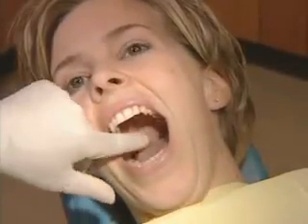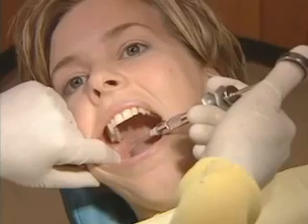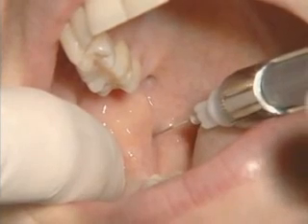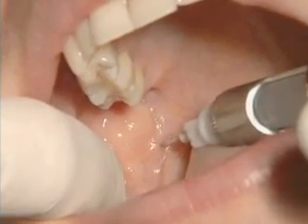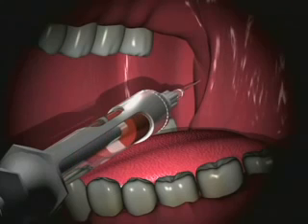After palpating the landmarks, you will be inserting the needle into the pterygotemporal depression. The needle is brought in from the contralateral side, and the insertion point is directly there, and you advance slowly until you go 25 millimeters. Once bone is hit, you withdraw slightly, you aspirate, and slowly begin to inject a full cartridge of local anesthetic, unless you are following with a buccal nerve block, in which case you should inject 3/4 of the cartridge.